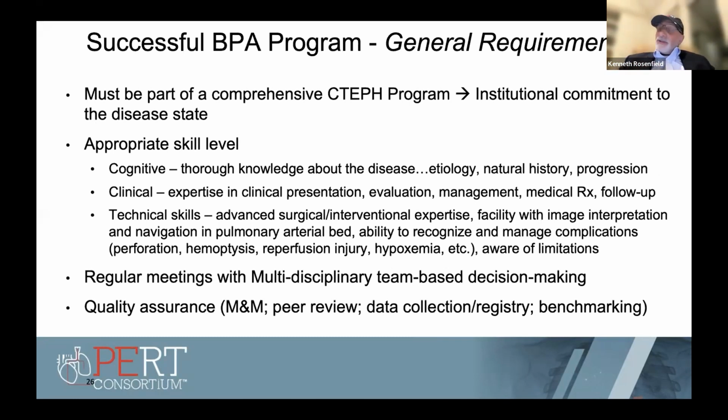You may even be able to continue a little bit of the dilatations, but it's immediate reversal and stop and make sure where you are, because you've already caused a little micro perforation. And believe me, if you miss it, that patient will cough. Even if you catch it, that patient will cough blood like the most scary stuff you've ever seen in your life. And you need to know how to stop that.